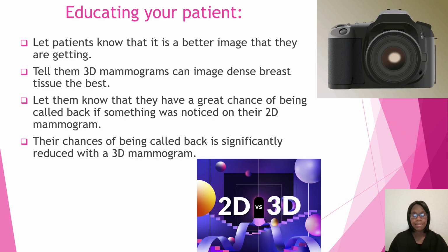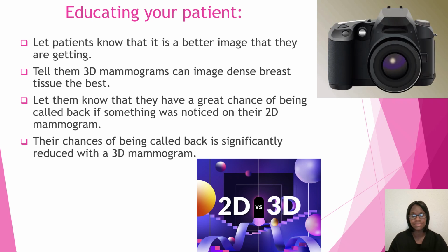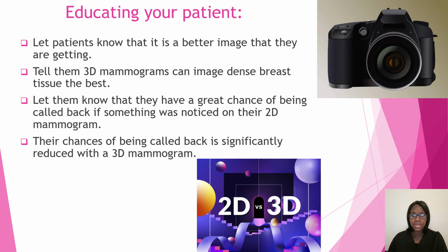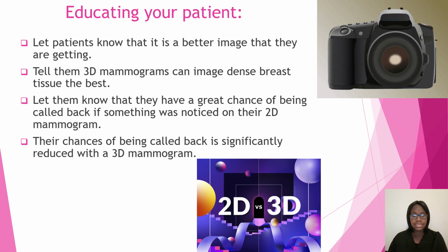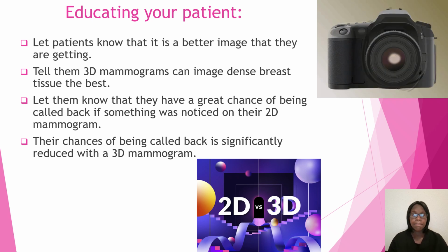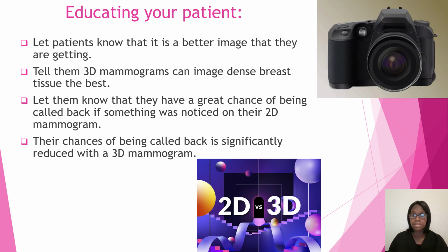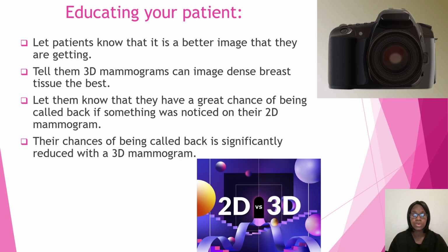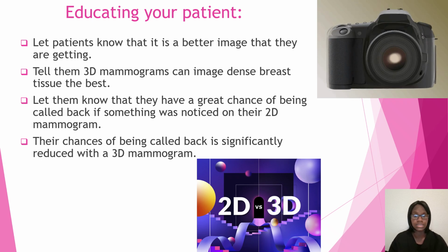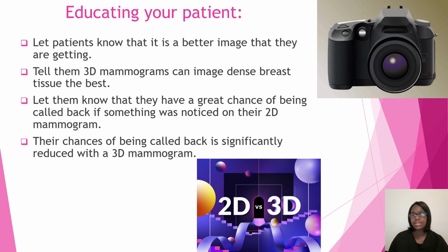Do you all remember? Let me know in the comment box, because I may be telling my age right here, which I don't mind. If you remember, there are digital cameras, your fancy digital cameras where you can download the picture, upload the picture on your computer, or just see it on your camera. Those give you the better crisp pictures. But you also have those cameras from years ago, probably in the 70s, 80s, or 90s, where you took a picture, but you had to go to a store to get it printed out. That's the example I give patients. One is so much better. You can see through, you can see all around it. It gives you like a 3D image. The other one, you really can't see much with it. So you can give them different examples like that.